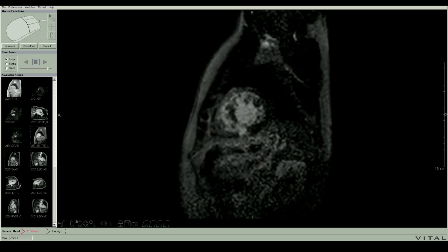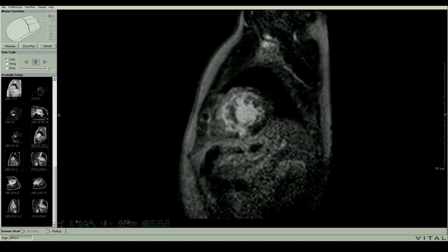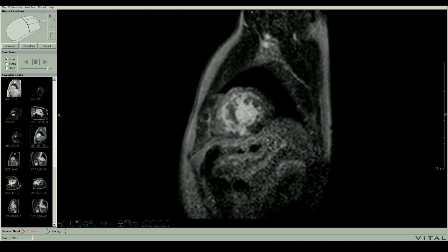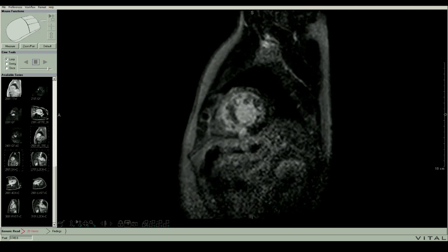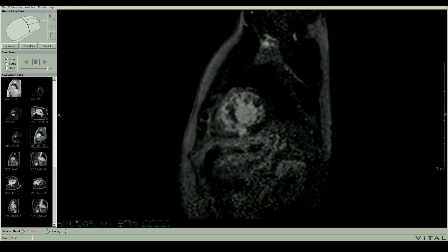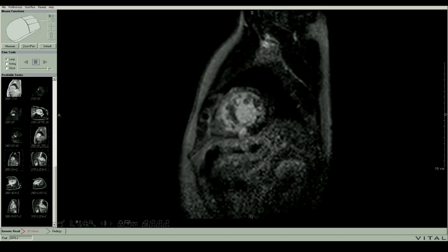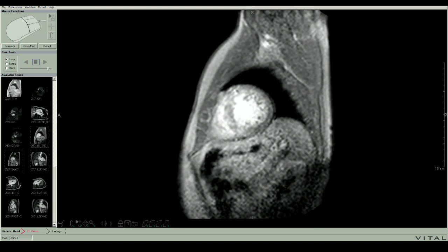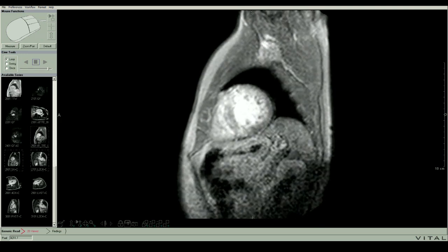Even knowing the blood pool doesn't null, the amount of gadolinium that's gotten into the inferior apical portion of the left ventricle there, septal, inferior septal, maybe mid. And so there's lots of gadolinium gone into this area of the myocardium, but we have successfully nulled this part of the lateral wall, this big hunk of the septum, but we haven't successfully nulled that, and that, which is basically gadolinium enhancement. And then we come all the way out till it's white on white.